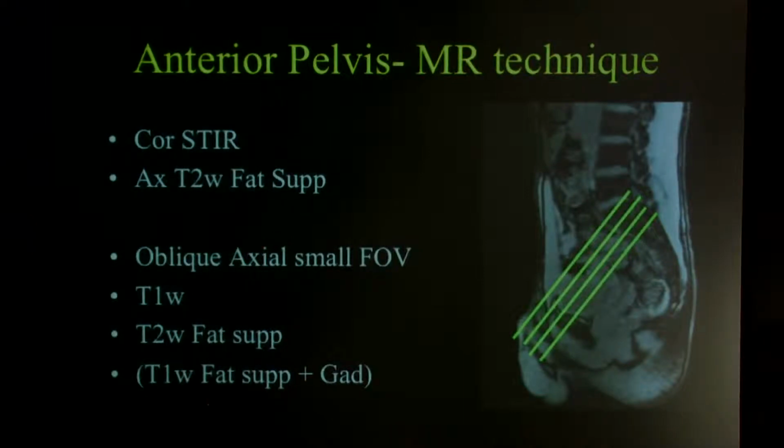And traditionally in Leeds, we always gave gadolinium. And when I arrived as a consultant, the corridors were awash with gadolinium. Everybody got it, no matter what you had, and it was the same for our athletes as well. And really, there's a number of reasons for that. There's laziness. People just gave gadolinium for everything. But also, at that time, certainly the MRI scanners and the coils that we put on patients to get good images weren't as good as they are now.